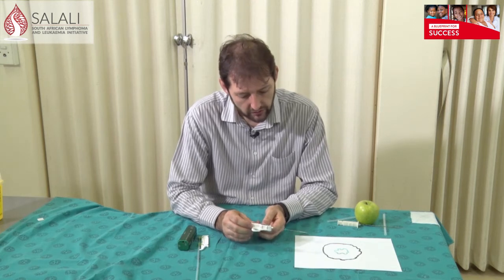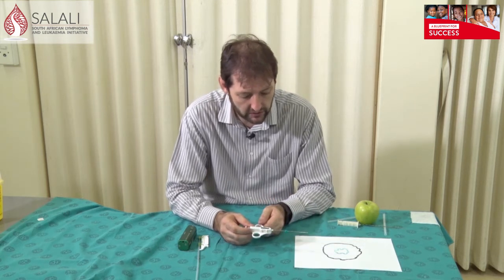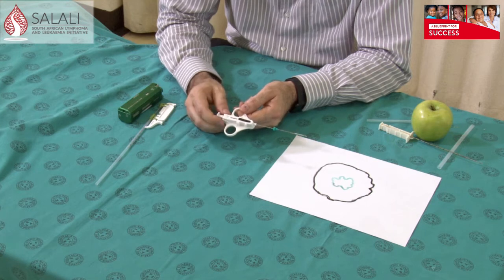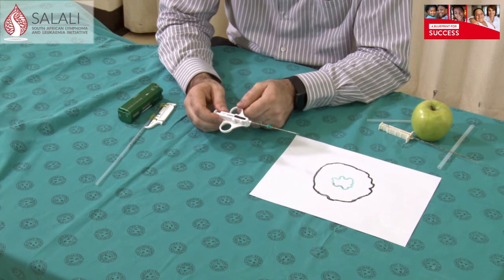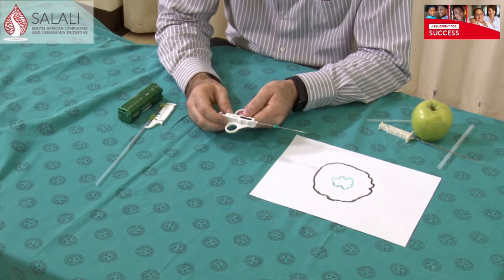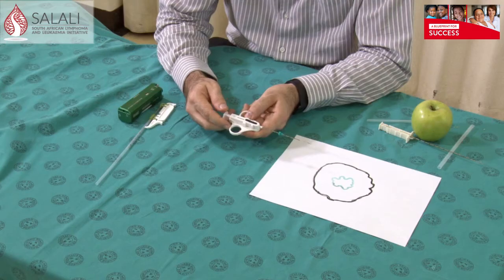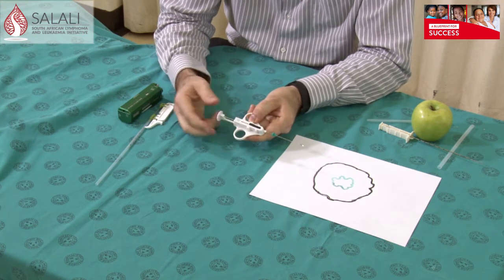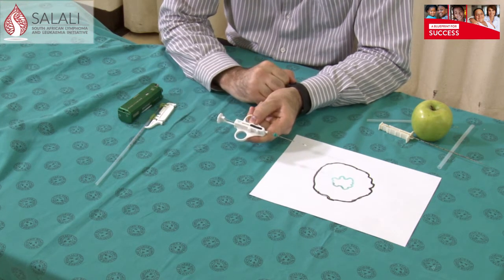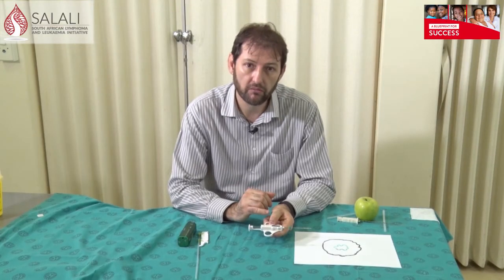The second needle is called a semi-automatic needle. You get different lengths and different sizes — this is an example of a 16 gauge 100 millimeter needle, which is good enough for a breast biopsy. The principle is you need to pull back on the back of the needle to engage it. This particular needle takes a 20 millimeter biopsy. Some manufacturers offer needles with a 10 millimeter biopsy option, while this one is set at 20 millimeters only.